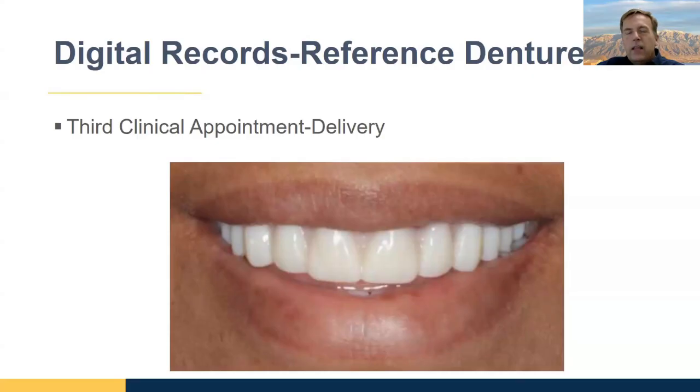It says, why is it not necessary to keep the dentures wet? It has to do with what they're made out of. They're not made out of acrylic. They're actually a printed composite material, and it just doesn't benefit them. They don't have that shrinkage problem that can occur with an analog denture. And I did look that up this time. The denture shouldn't be stored in a moist environment because it doesn't need it, and it'll help prevent bacteria growth and stuff like that.